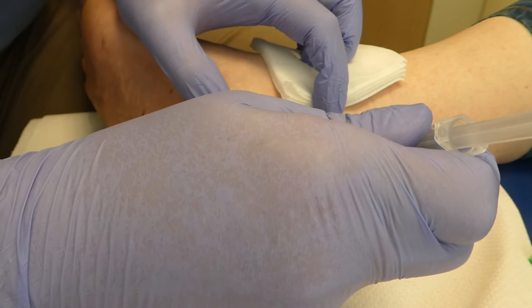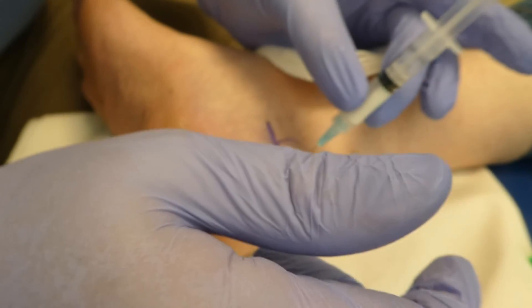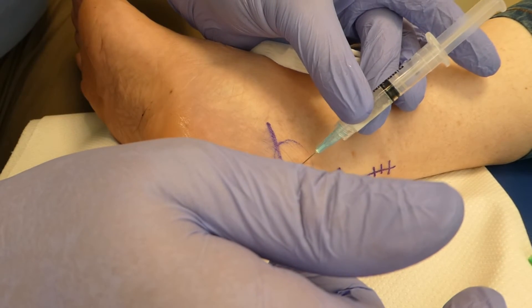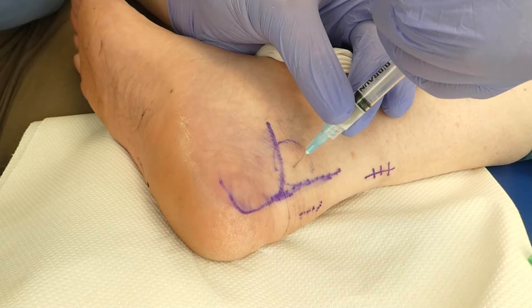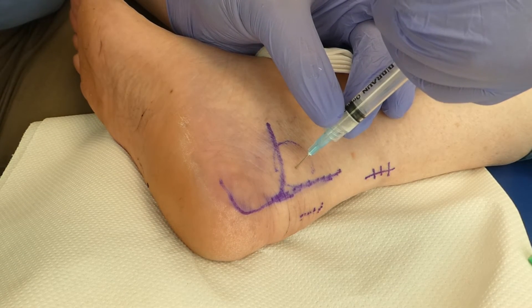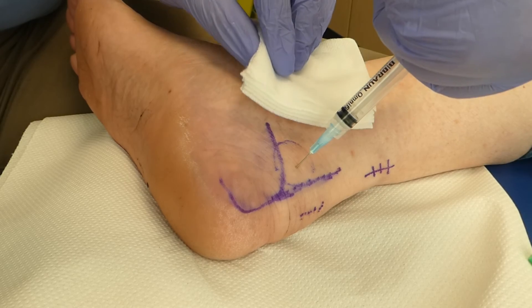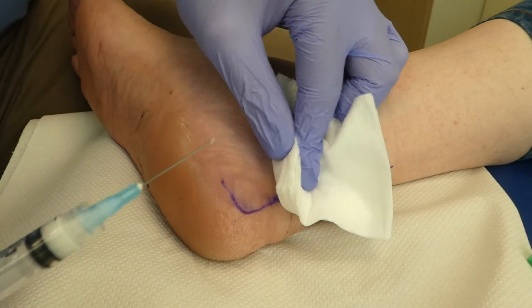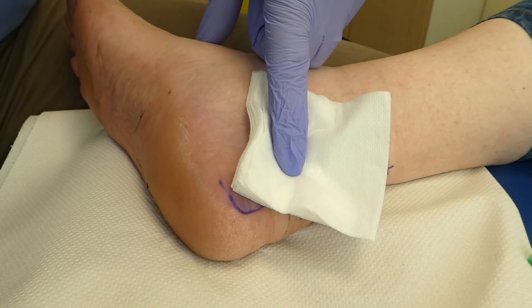So a little scratch coming up — three, two, one. We know the artery is coming down here, so we're away from that. And then we're just going to very gently joystick that into the hot spot. My patient just let me know we were in the right area there. A little sting going in — I'm going in very gently and feeling how that injects, also responding to how my patient's reacting. There's a little bit of resistance, and that tells me I'm in the right area. Look for any sign of bleeding — a little bit. There's a little bit of fluid coming out, so pressure just keeps it in. Amazing — and that's it done.